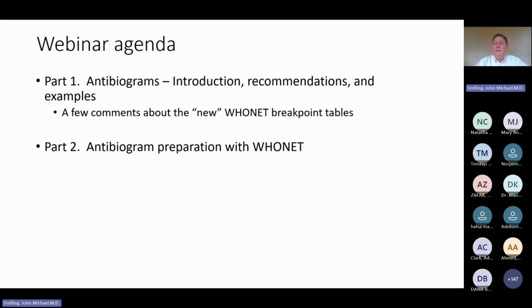Those are very important, and I'm happy to follow up later by email and other sessions for talking about the new tables. Broadly, we'll start off with the PowerPoint about antibiograms, their purposes, uses, objectives, some recommendations, and some examples.